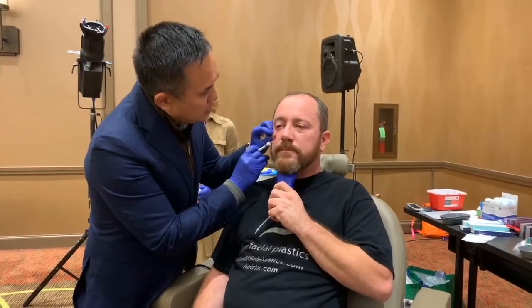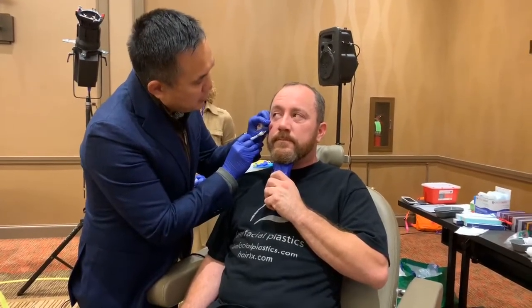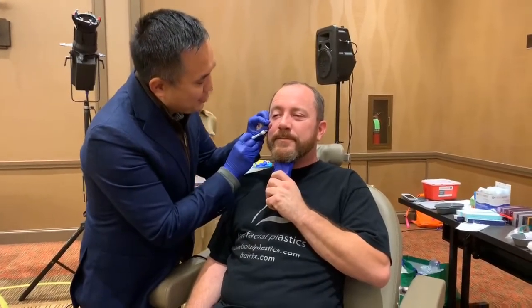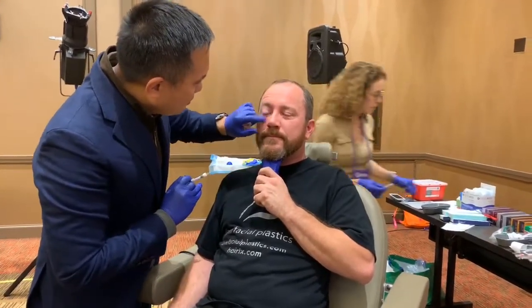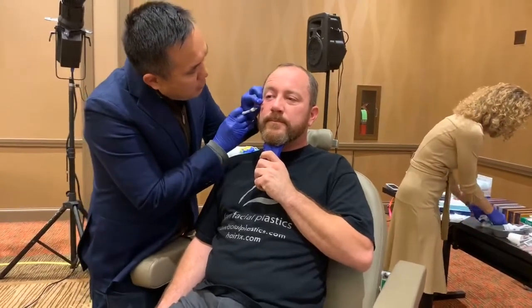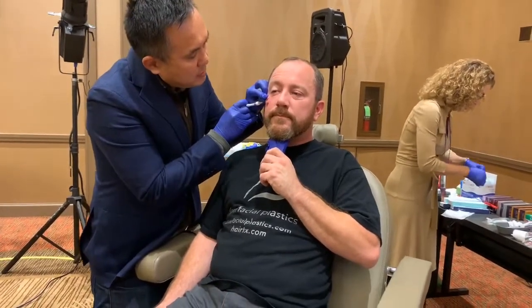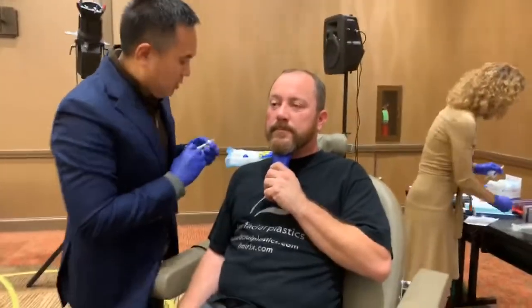You can start to see that one side compared to the other is dramatically improved. You can see there's a nice improvement. One helpful point of commentary: everyone injects to the orbital rim — that's obvious — but I think it's also helpful to look above and below where you've injected and go above and below the orbital rim. That can be very helpful.